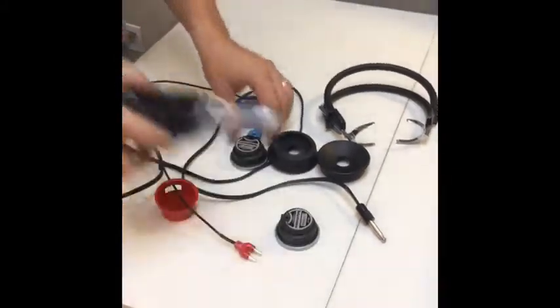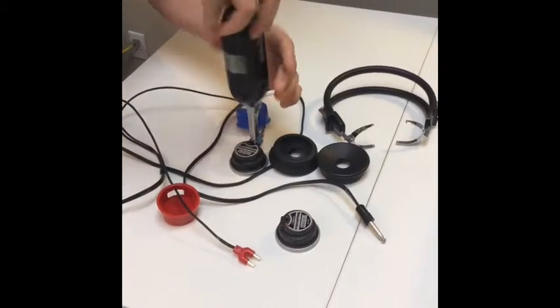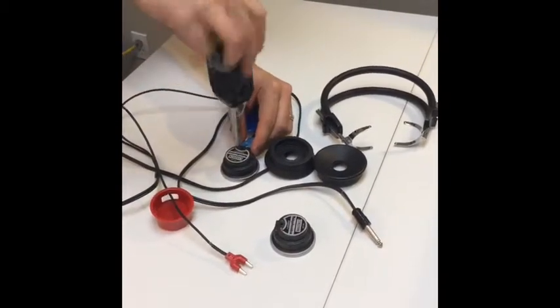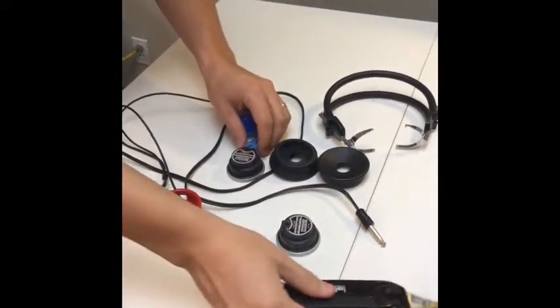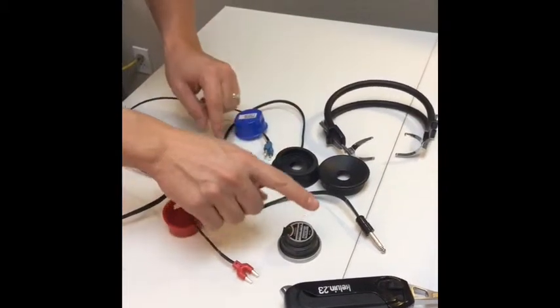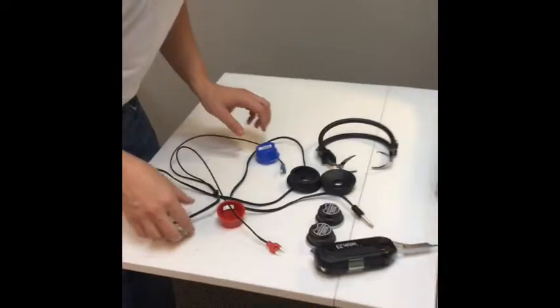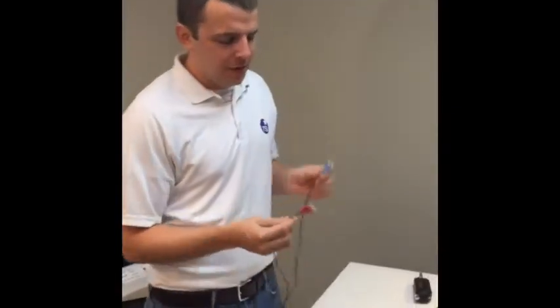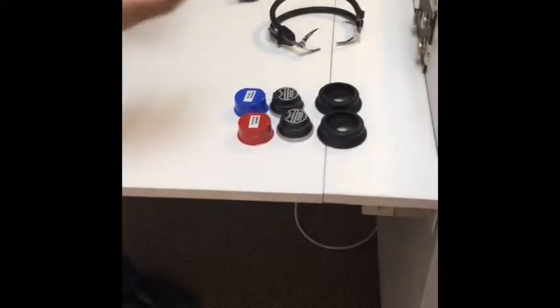We'll do the same on the left side — two to three turns to loosen each screw — then slide those out. We'll note that this is our right and this is our left. Now we'll get our replacement headphone cord. We have red for right and blue for left. I've lined these up as I disassembled them so we can just put them right back together.